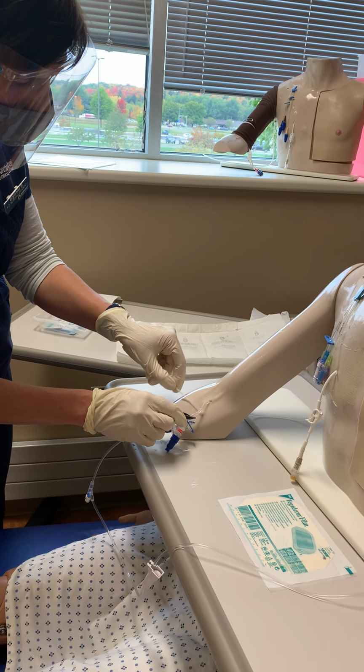Next, I would grab my chlorhexidine and I'd click it. I would wait till that dried, the alcohol, and I would also have scrubbed according to the facility protocol. I've clicked it, so now I'm going to scrub. This is my actual antiseptic, kind of going in a circular motion around it. Definitely inward, outward. I wouldn't want to bring germs towards it.